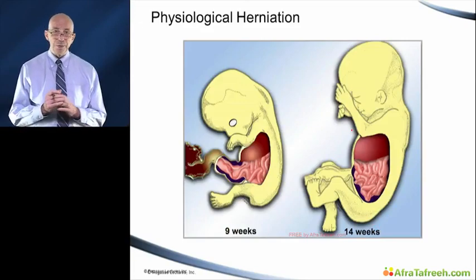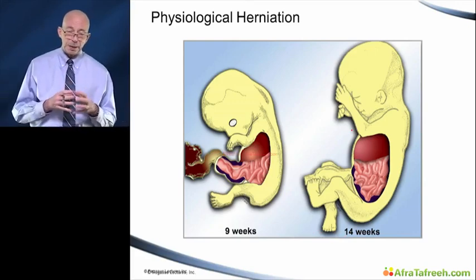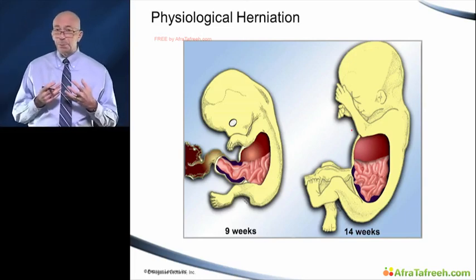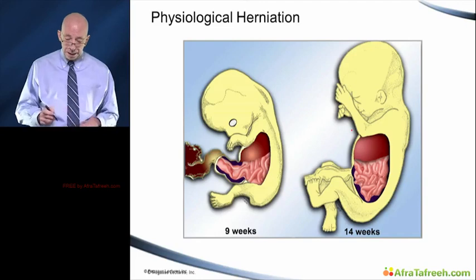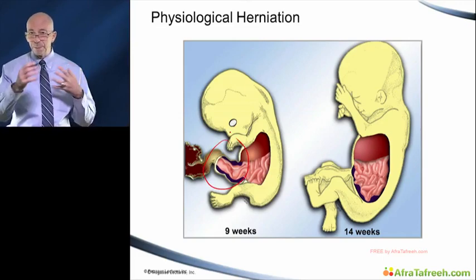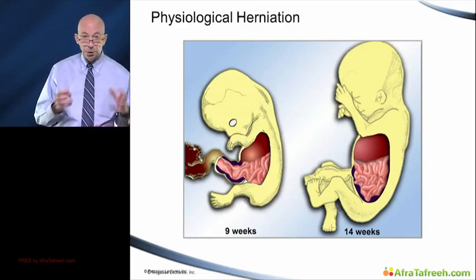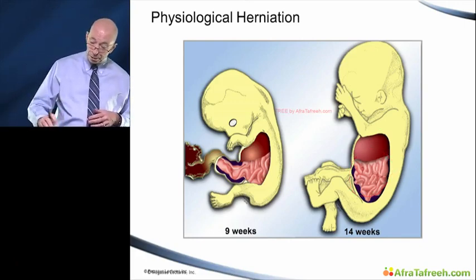Of importance is an understanding of the early fetal physiological herniation. In the embryo, and up till about 12 menstrual weeks, the abdominal cavity is filled predominantly by liver. There's no room for the gut to form within the fetal abdomen, so it herniates out into the base of the umbilical cord, where it begins its early development and rotational evolution. This is a normal finding. By about 12 weeks menstrual, the midgut herniation should have been reduced, and the gut should have returned to the fetal abdomen.